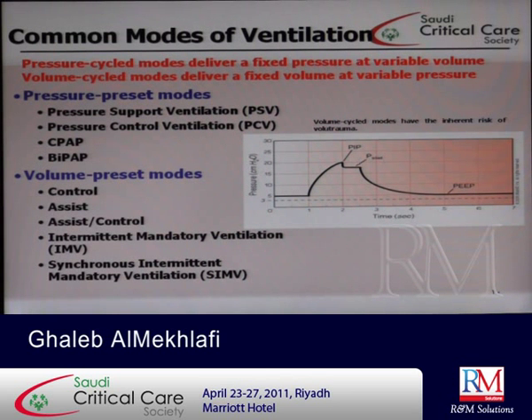If it is mixed, then it can be assist control or IMV with pressure support or SIMV with pressure support. So you have both. You have controlled breaths, that are totally delivered to the patient by preset values, or the patient is doing an effort and we are just helping him, and besides that he is also taking mandatory breaths or control breaths. Clear?